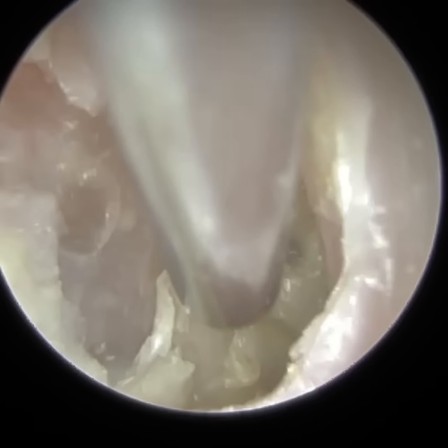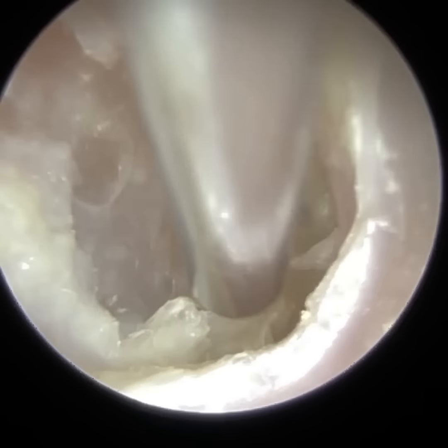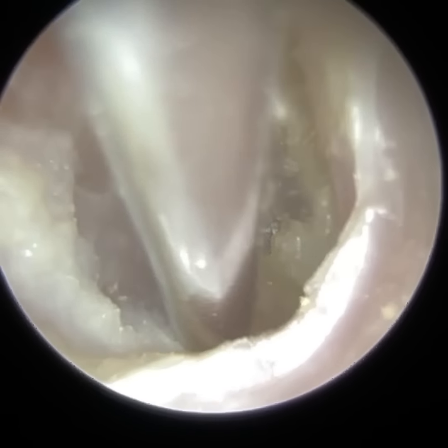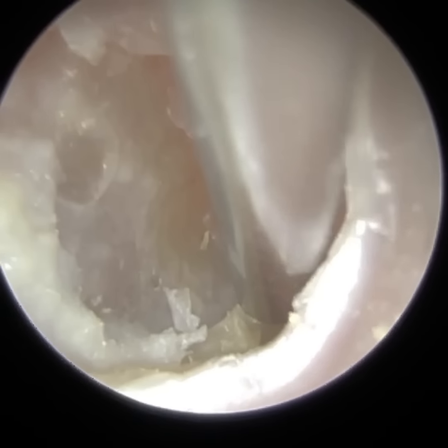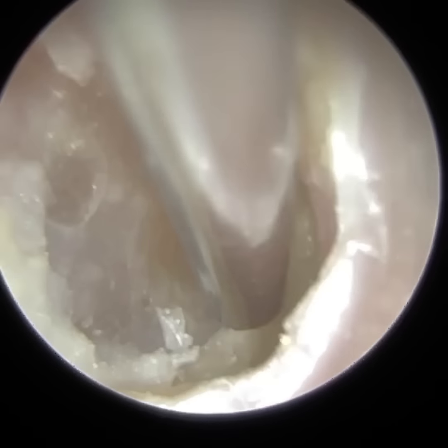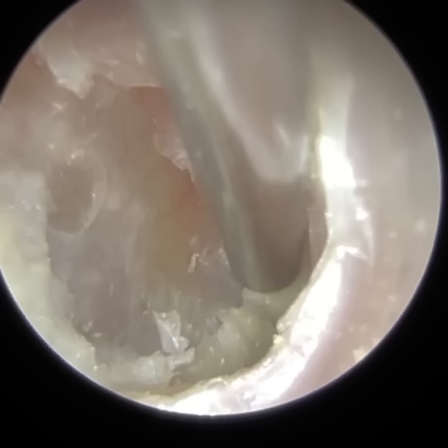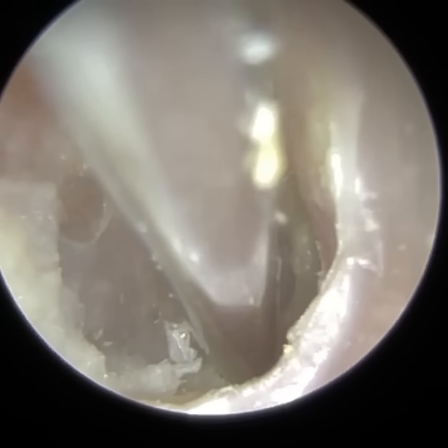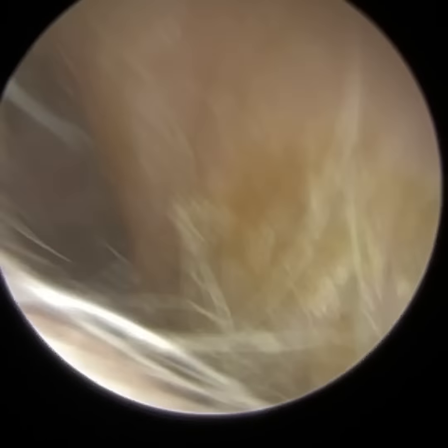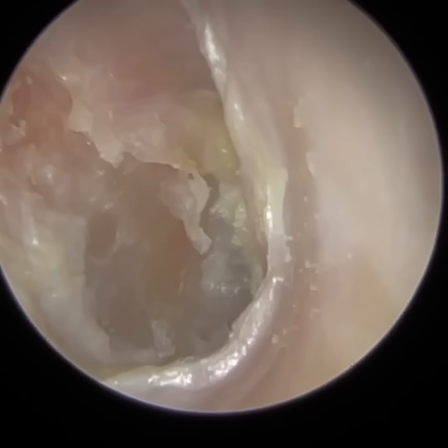You have a separate handle that uses a luer lock mechanism. The suction handle has a male connector and the suction tip has a female connector, and you push it on. If I want the standard Zollner size, I attach a 14 gauge suction tip onto the handle, and if I want a fine end, I remove that and attach the 17 gauge suction tip.